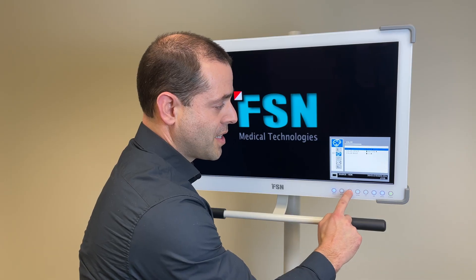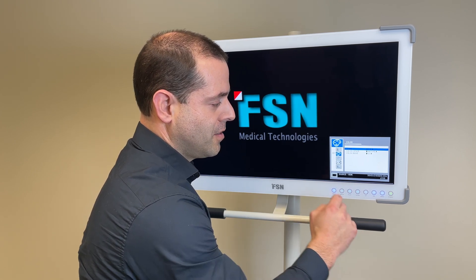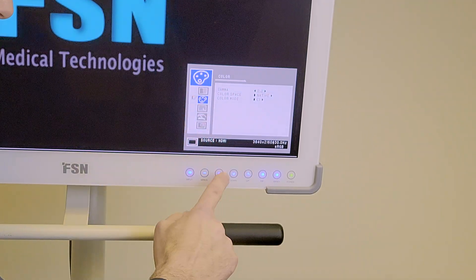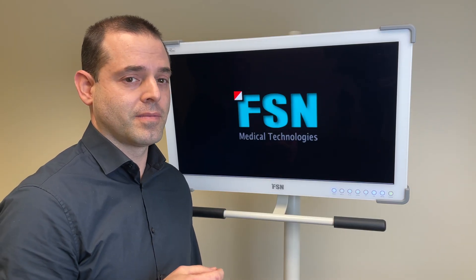You can go plus or right, or you can change or select that option to change to what you want. To back out, press the menu button, and menu again to remove the on-screen display. Pretty simple.